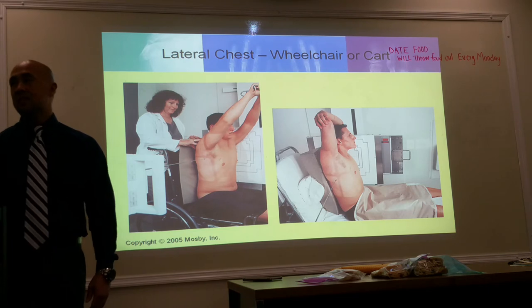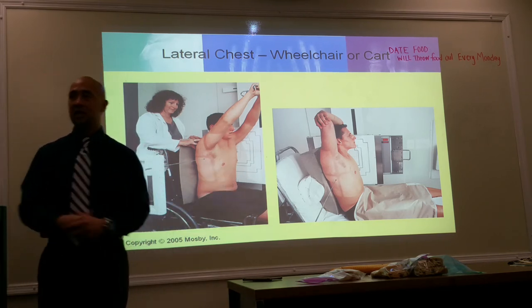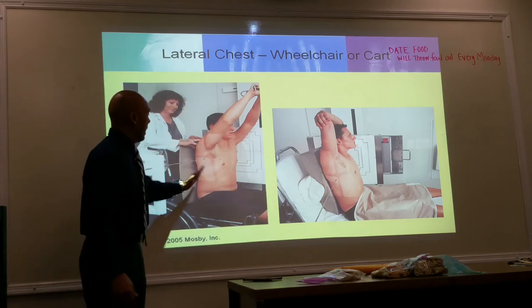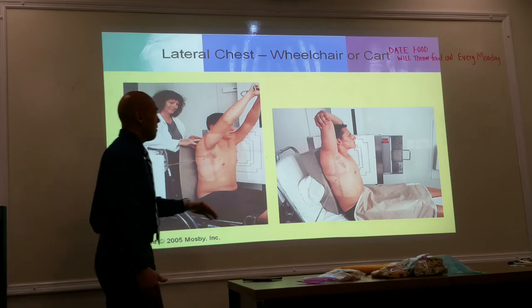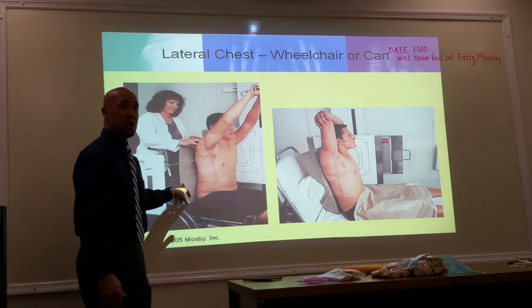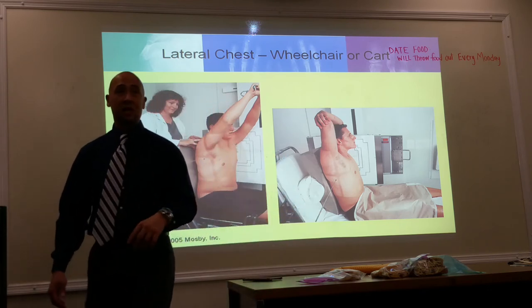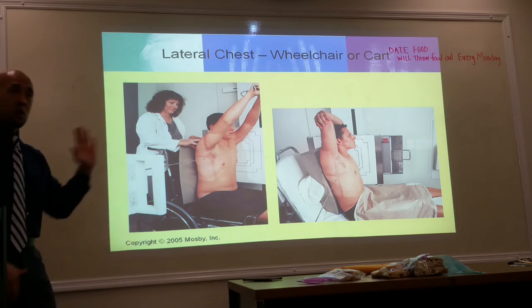Okay, lateral chest. Again, these are for patients who cannot stand up, so these are some variations. If they're on a gurney or a bed, you need to prop them up, because if they are sunk into the bed or the wheelchair, you're going to get the arms of the wheelchair or the side railings of the bed inside your view. It's going to cut off the posterior part of your lungs, so you want to prop them up.